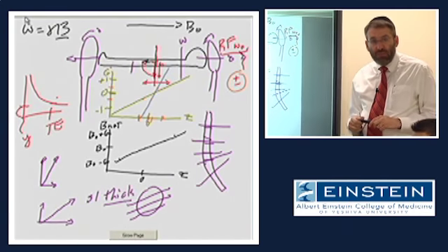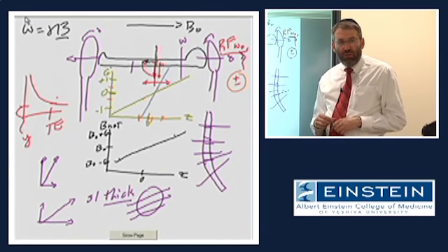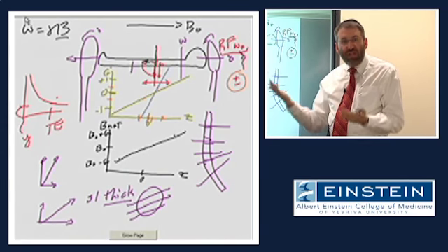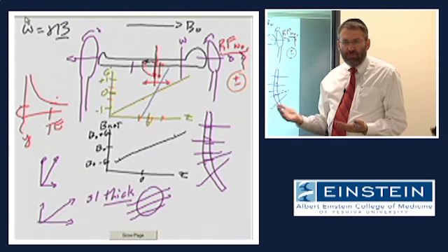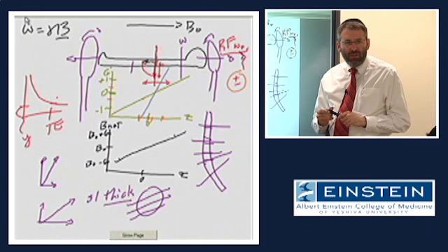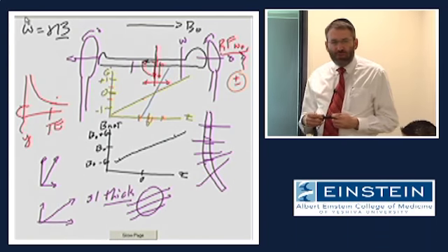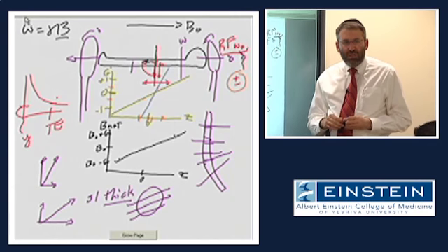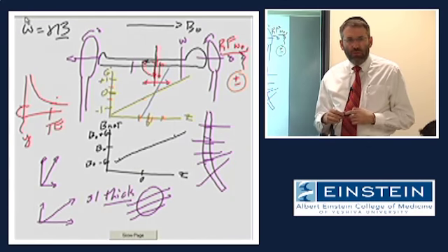That being said, it is possible to generate an asymmetric gradient magnetic field, as you described, simply by putting an asymmetric amount of power into each end of the gradient. But that's not something we're going to deal with at all. And certainly in clinical and most human applications, it really doesn't have a role. So isocenter is always going to remain where it is.